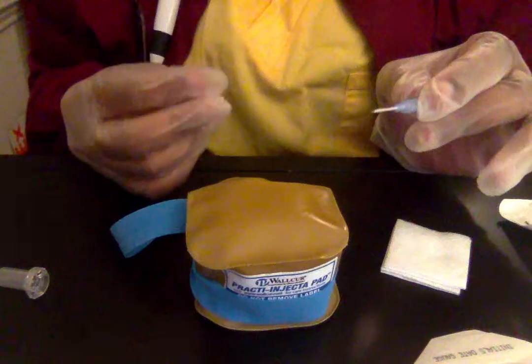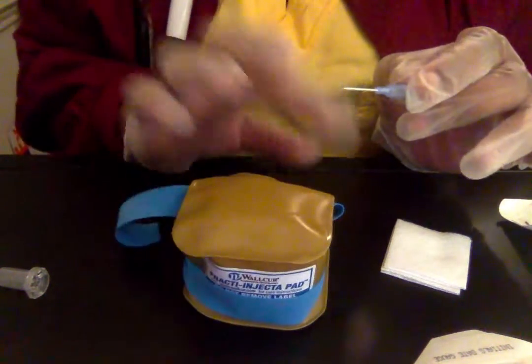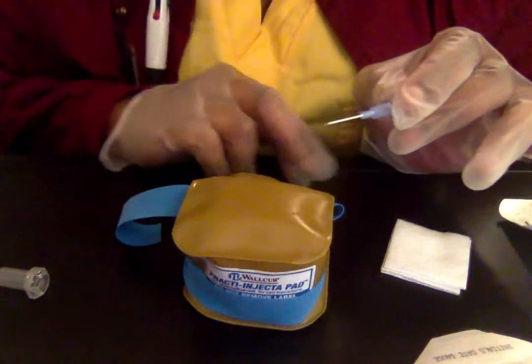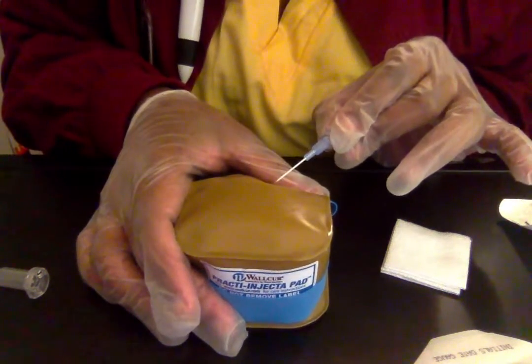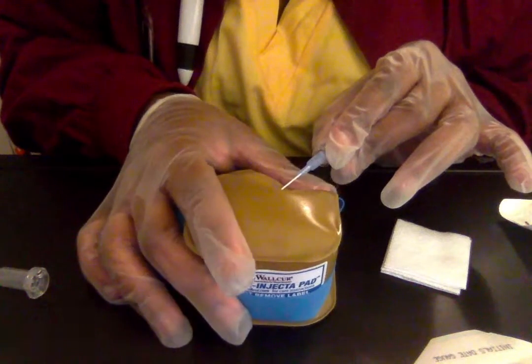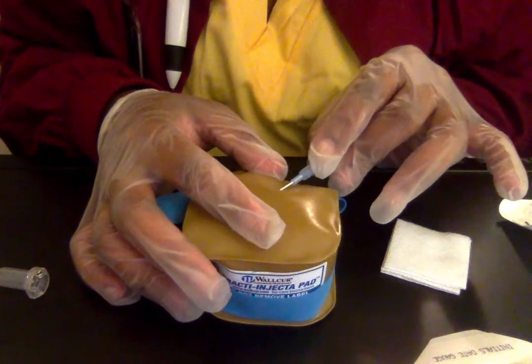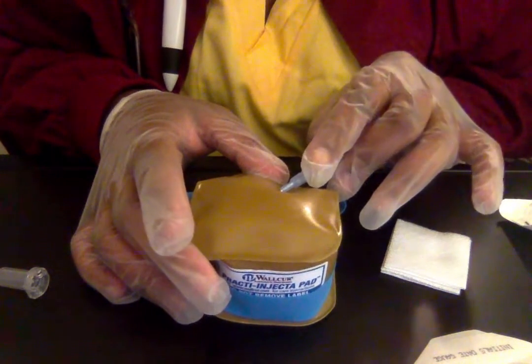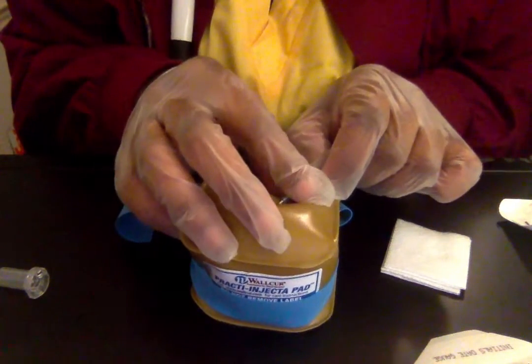Now I would want to taunt the skin. I don't want to taunt it up because I don't want to accidentally hurt myself, so we're going to taunt it down. And we're just going to go in at a slight angle. Okay, and now we're in. I've got a little bit of flashback, so I'm going to level out and start to advance the catheter. Now that it's advanced, I'm going to take the needle out and make sure to occlude in that area.